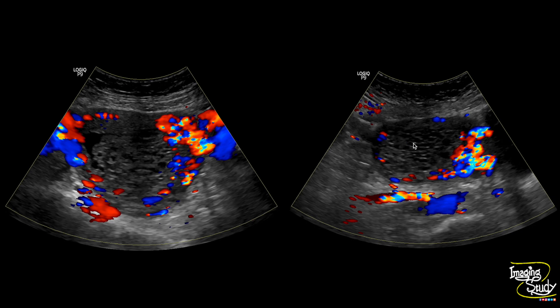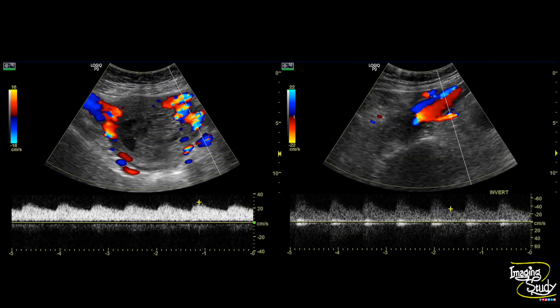If you are interested in color Doppler, I always advise putting color Doppler on any lesion you encounter, and when you do, don't forget to take a spectral sample from that area as well. We have taken the sample — on the right image you can see the right uterine artery showing low-impedance flow with a good amount of diastolic flow; the early diastolic notch is also absent. On the left image, the sample from the tornado vessel is also showing low-impedance flow.